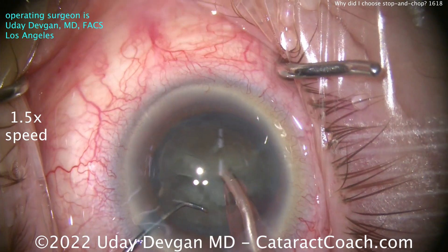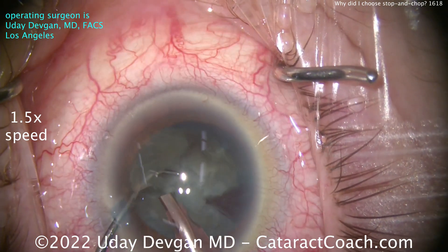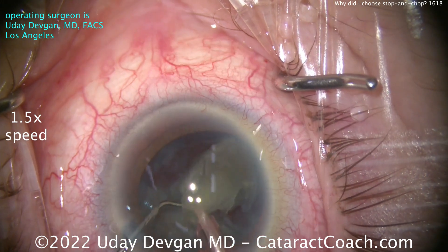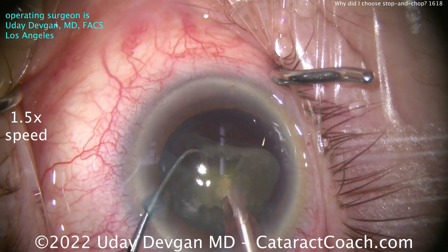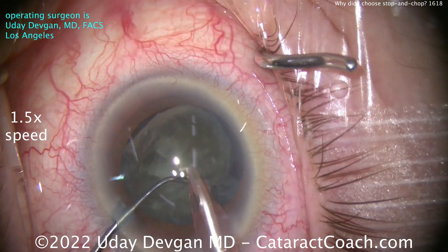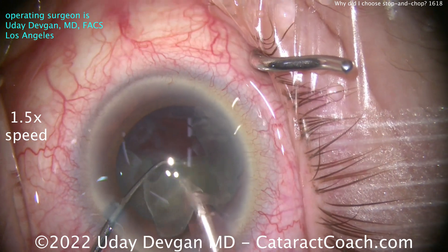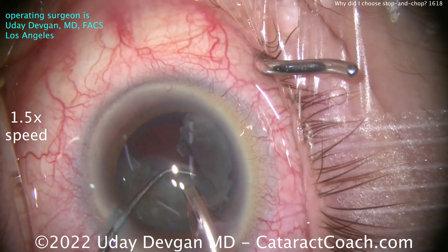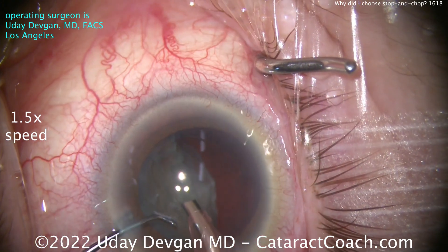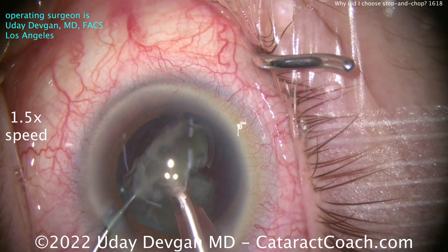Very controlled removal of the nucleus. In a patient like this, my goal is to be very delicate, very deliberate, and to do very atraumatic surgery. In a case like this with a real crowded anterior segment, I'm a little crowded and don't feel like I have a lot of room to work. It's easier to do a lot of this debulking when the lens is still in the capsular bag. Here we're taking out the remainder of the first half. Now you can see half the nucleus is back in the bag — it's a little less than 50% volume because of that big groove we created at the beginning. Now I can chop it and remove it.